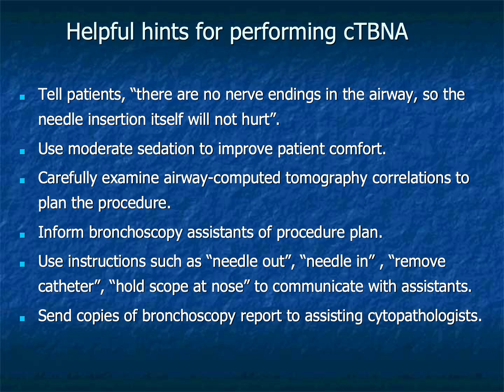Many technical refinements contribute to the success of conventional TBNA. Patients should be reassured that the airway itself contains no pain fibers and that needle penetration through the bronchial or tracheal wall is usually not painful. Moderate sedation improves comfort while preserving patient cooperation. Perhaps most importantly, careful review of computed tomography images before bronchoscopy allows the operator to mentally reconstruct the relationship between lymph nodes and airway landmarks before entering the bronchoscopy suite.